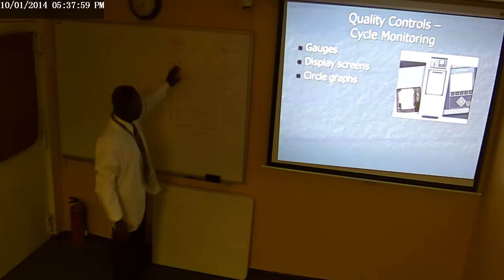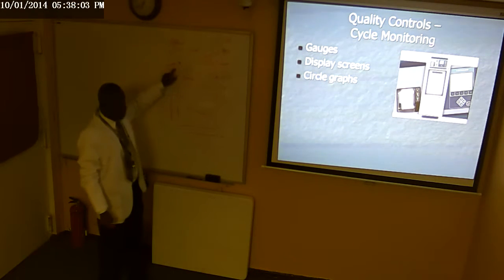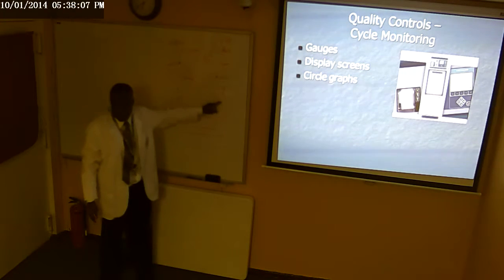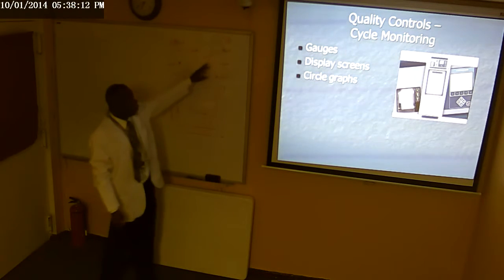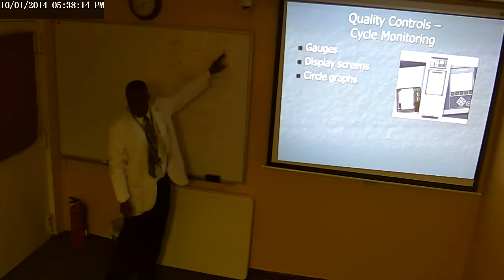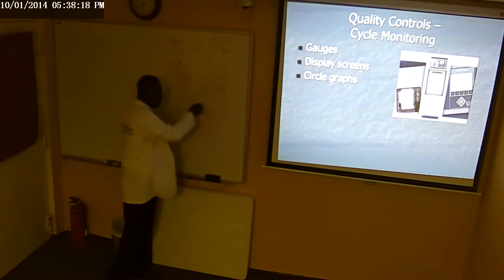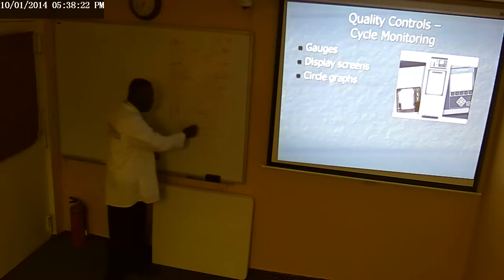But there's steam in the chamber gauge. But then there's always steam inside the jacket. So always, because there's steam in there, there's steam pressure in there, to be pointing to what? 30 pounds. At the time when you start the process, steam leaves the jacket and comes into the chamber. And after conditioning, the steam will build pressure up to what? 30 pounds to equal here.